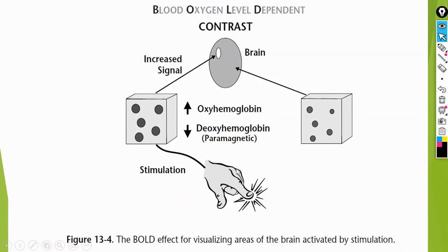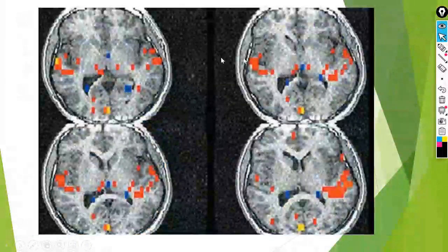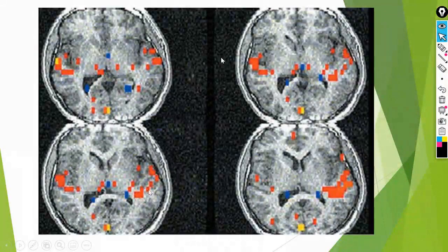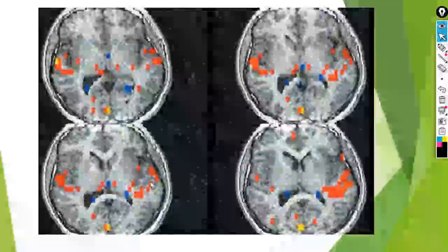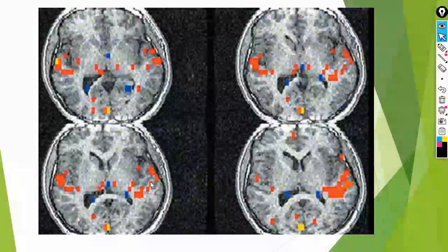It is very quick, and they call it the BOLD technique. It tells you about the areas that are hyperactive or those with high oxygen supply. You want to benefit from this. Do you see the function of the part of the brain responsible for movement, or the stimulus or the reaction that will occur? Is it working efficiently or not? Do we understand? The BOLD technique, everyone.